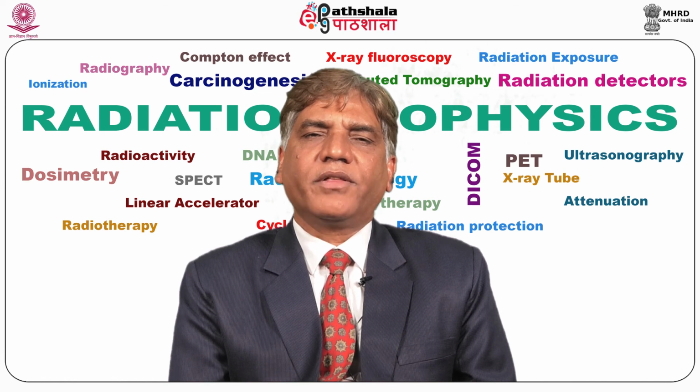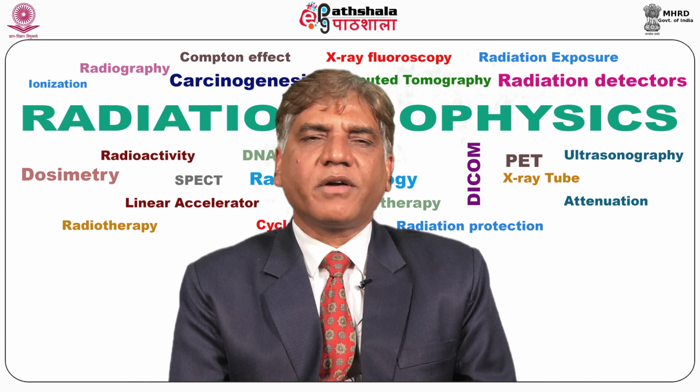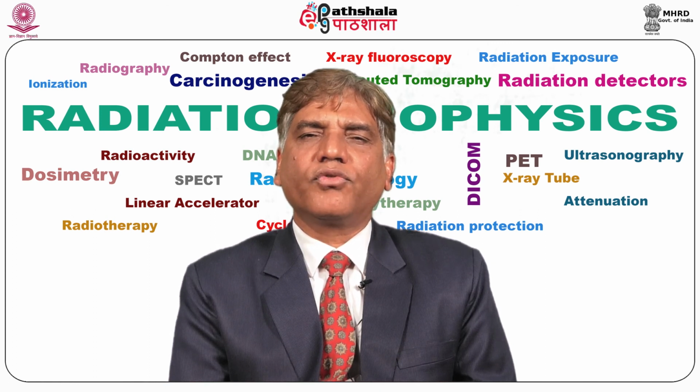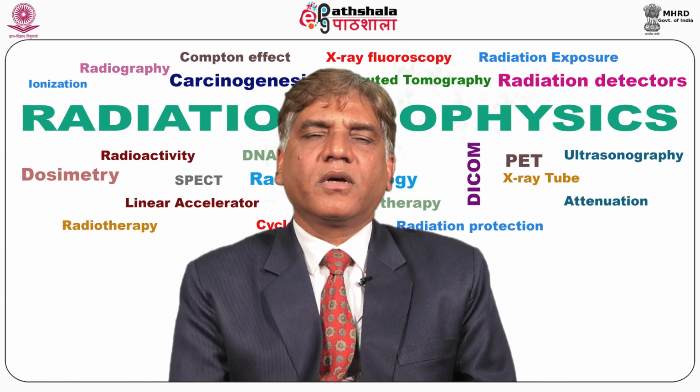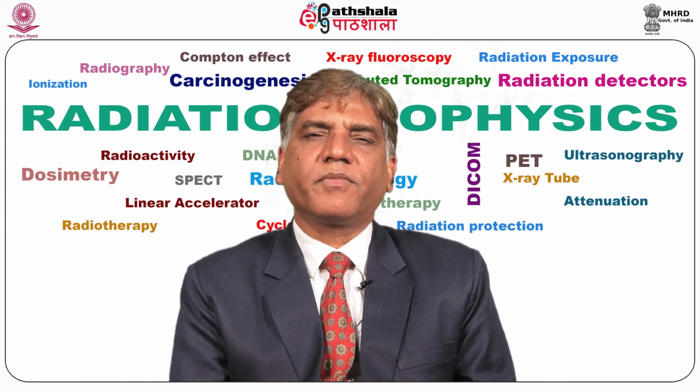The database server is the main component of PACS. The server holds a database of all patient examination information. This database includes details of patient demographics and the examination. It is also used to perform scheduled tasks required for system maintenance, such as backup.